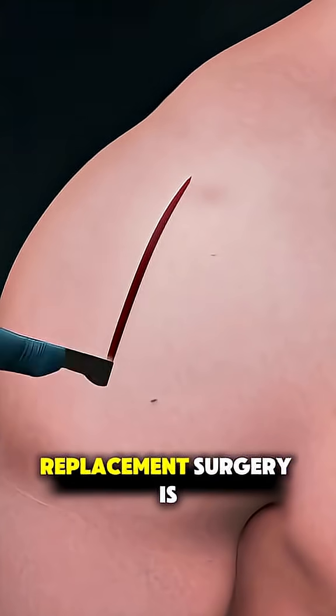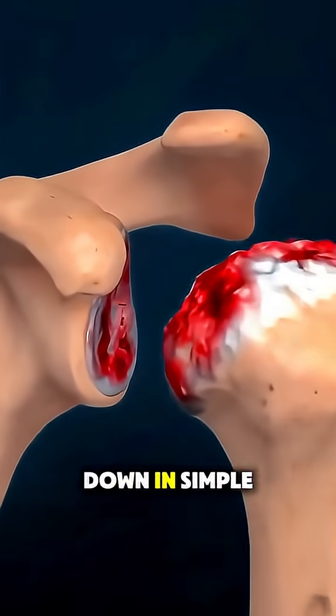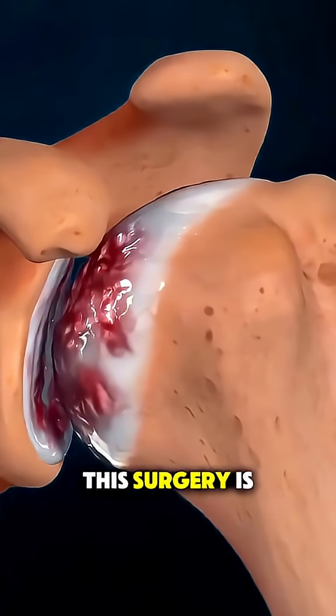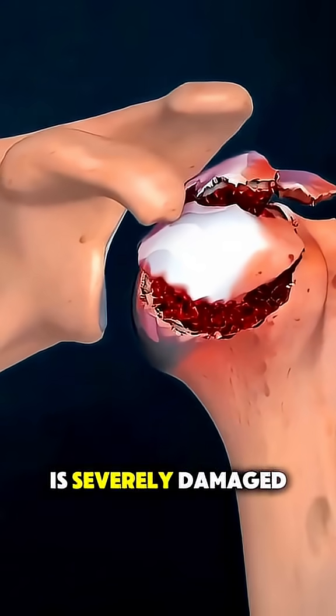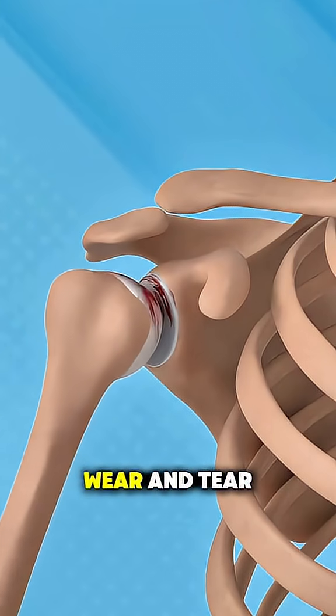Ever wonder how shoulder joint replacement surgery is actually performed? Let's break it down in simple terms. This surgery is done when the shoulder joint is severely damaged by arthritis, injury, or long-term wear and tear, causing pain and stiffness.